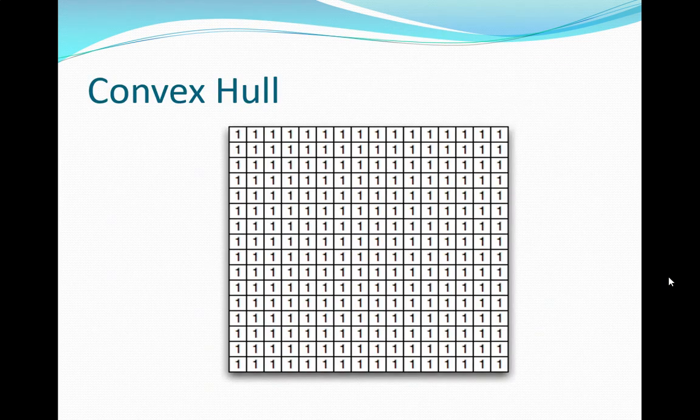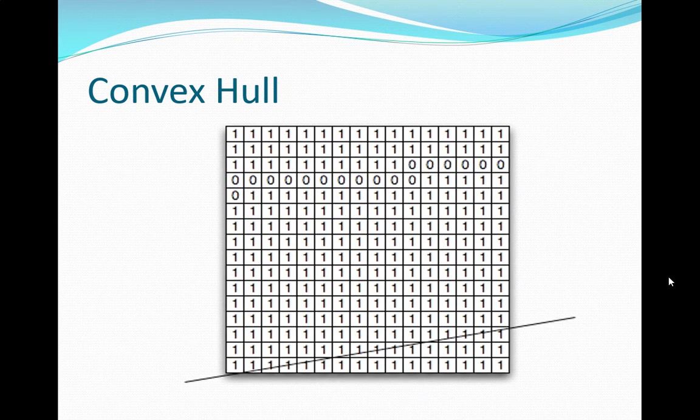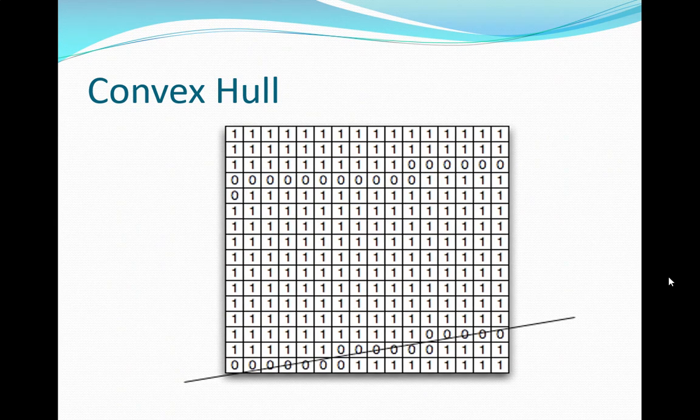So here's the idea. Imagine I assume everything in the volume is part of the object. And then I got one of these protons that missed the object. Well, if it missed the object, everything along that straight line, it will be a straight line, so I checked that it's a straight line. I checked it lost basically no energy. I go, well, everything along that line had to not be object. So I can zero it. It wasn't in the object. I have some other one that went through, lost no energy. I zero everything along that line.